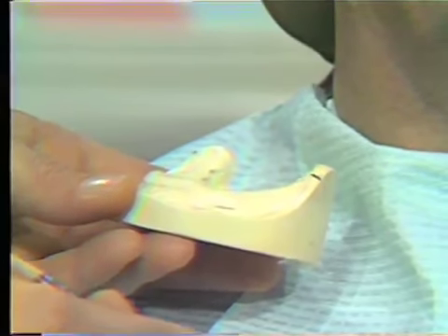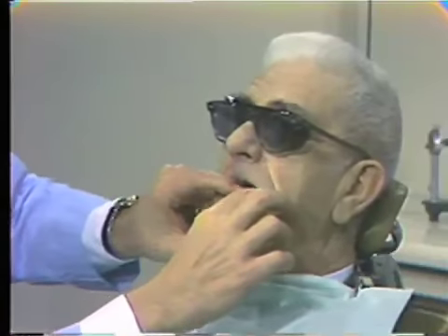We are now going to go to the patient. And the first observation we will make in our patient is the relationship of this plane of occlusion, or tentative plane of occlusion, with the corners of the mouth. We want the plane to be at or below the corners of the mouth. So we'll place this in the mouth, seat it firmly, and just let Mr. Monahan close for a moment. Now just open slowly, right about there. We want the mouth open just part way. And now we will observe the relationship of this wax rim with the corners of the mouth.